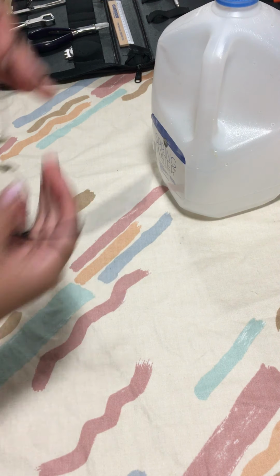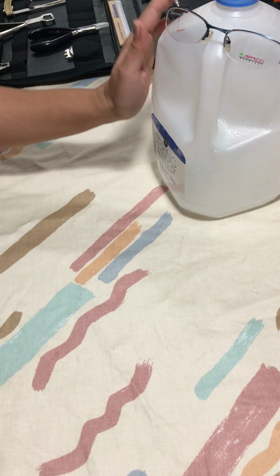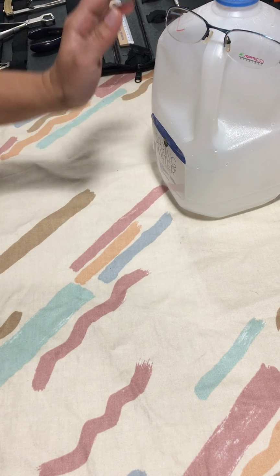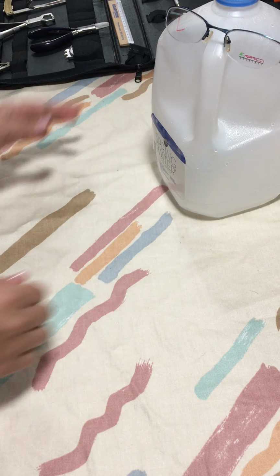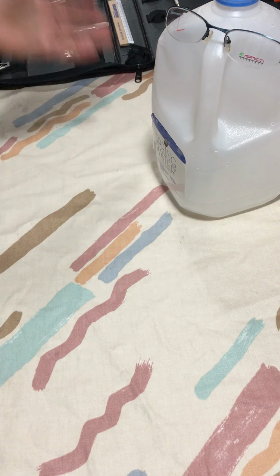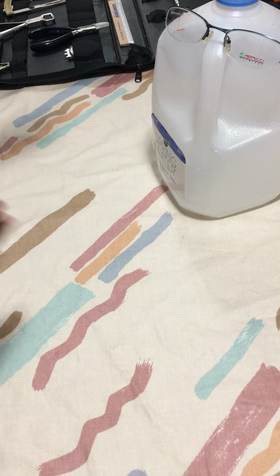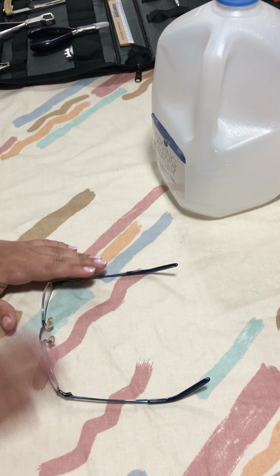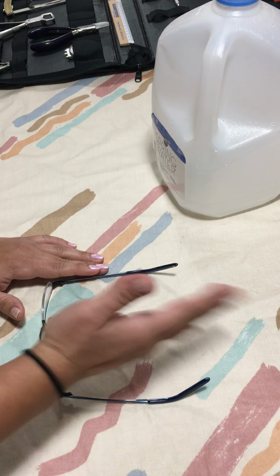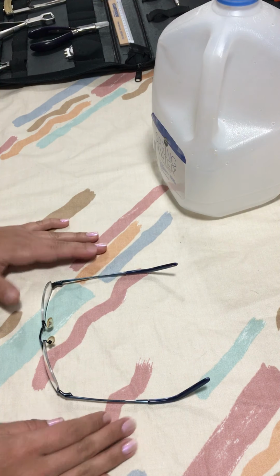This side. Right, when I put it on the patient, I do notice that this side, so the side that is more outwards, is actually closer to the patient's face. So I see that this whole side is actually closer to the patient than this side, okay? So because the right side is closer, that's gonna be the side that I'm gonna be bringing in. I could either bring the right side inwards, or the left side outwards. But we are gonna be working with the right side because I noticed that it's the one that has the outward temple as well. Temple should be more or less 85 to 90 degrees angle, and this one is much more.